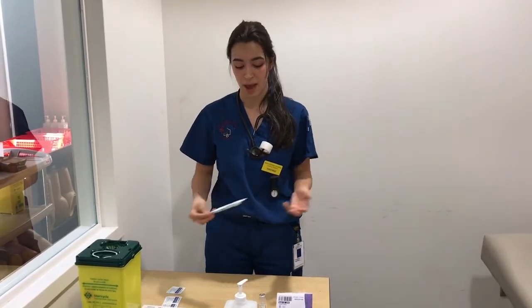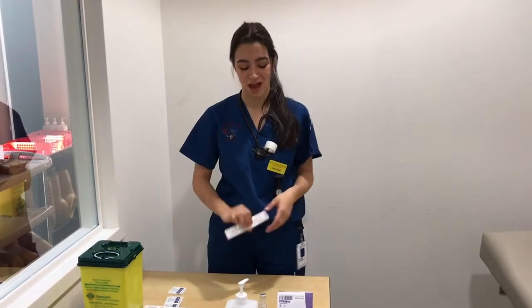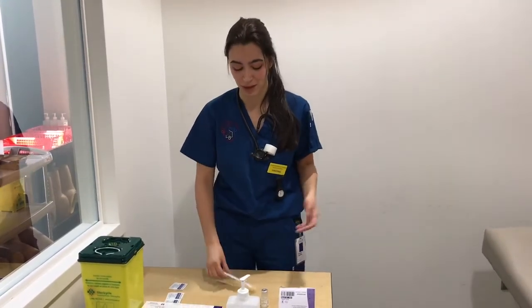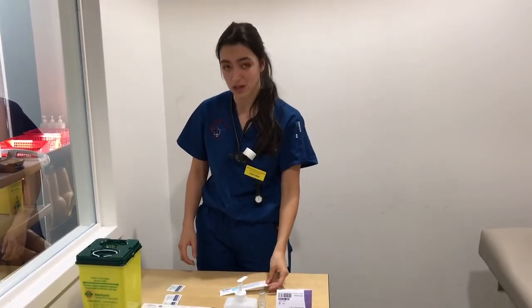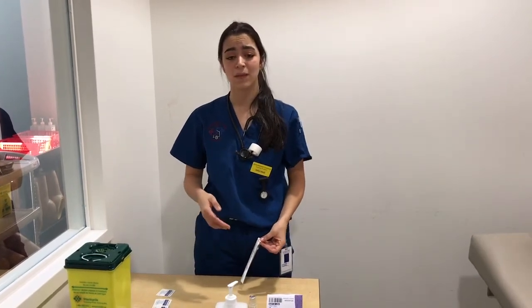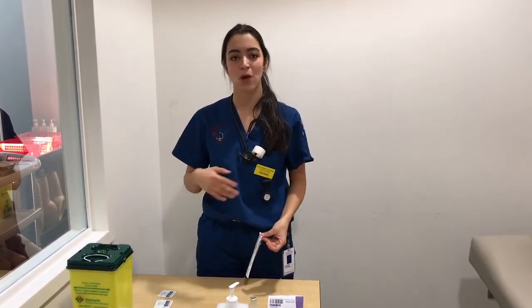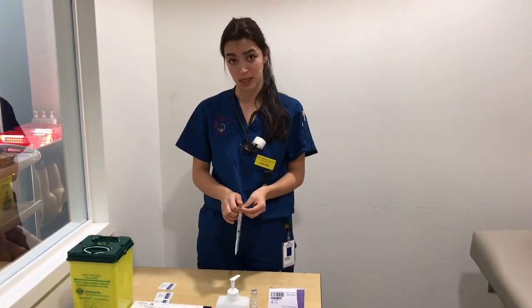So next what I'm going to do is I'm going to do the same thing for the intramuscular injection needle. I also checked the MAR, and surprisingly, you also need 1 milliliter of sodium chloride, which just happens to be here, the expired sodium chloride. And we are going to do the exact same process as we did before as a subcutaneous needle. Because I've already explained it, I'm not going to be going through this in as great of detail, but I will still be using the appropriate technique.